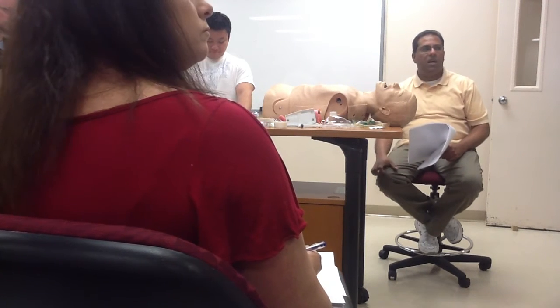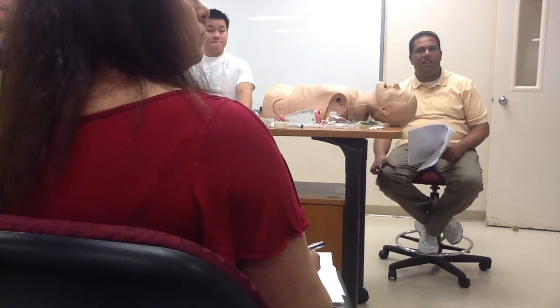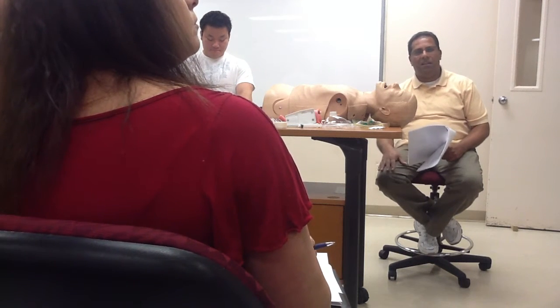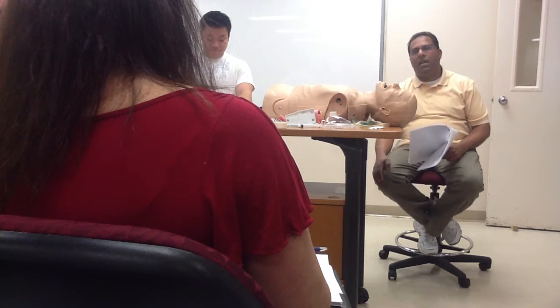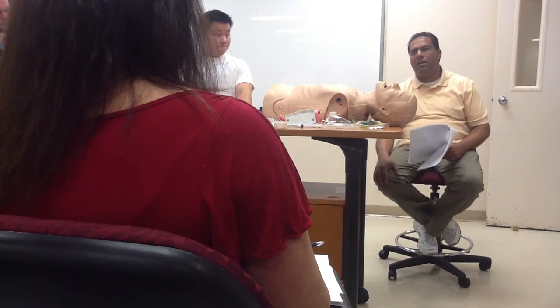Does every intubated patient with an ET tube have to be on a ventilator? No. Only when indicated. When would they not be on a ventilator but intubated? Surgery? They're breathing on their own. That's one good reason, I would think. Surgery, trauma.